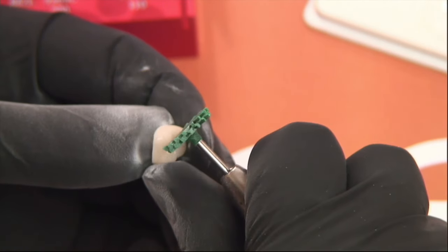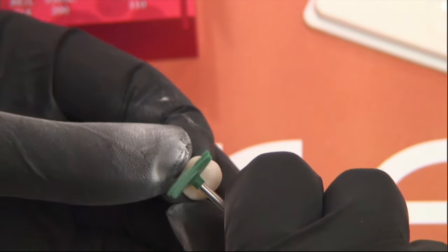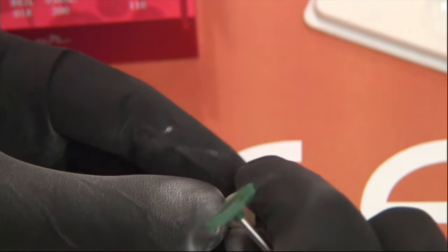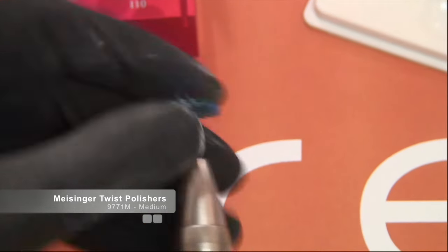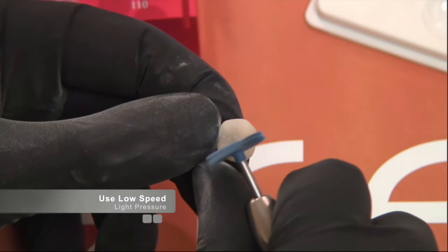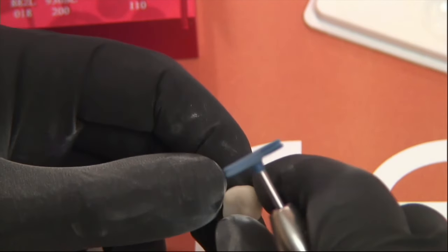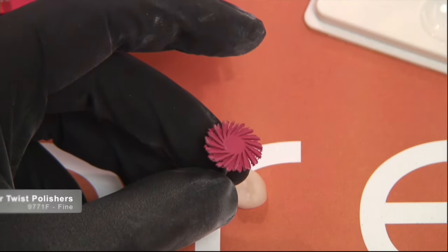We'll start with the coarse twist polisher. It's important to note that when polishing Vita Enamic you want to use low speed and light pressure — no heavy pressure. Run the polisher consistently; these twist polishers work well to get into the occlusal anatomy. Once the coarse polisher is complete, use the medium — these are the 9771 medium polishers — again at low speed with light pressure. You want to run right around 12,000 RPM at most, as recommended by Meisinger for Enamic.